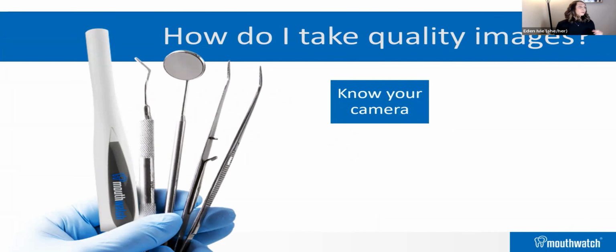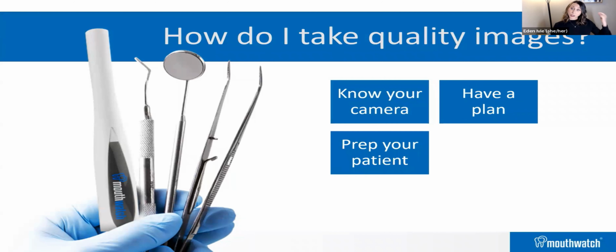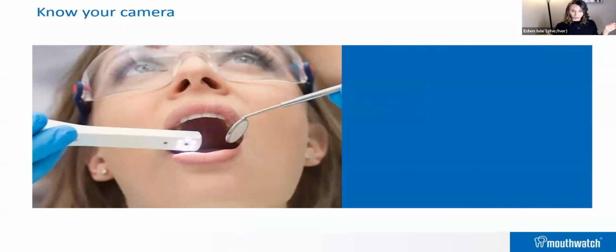So first of all, you need to know your camera, and you need to know your camera before you have a patient in your chair. You need to have a plan, you need to prep your patient, and you need to prep the teeth. And you need to stabilize. This is the number one most important thing in taking good images: stabilization.